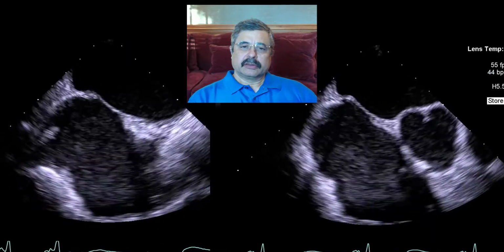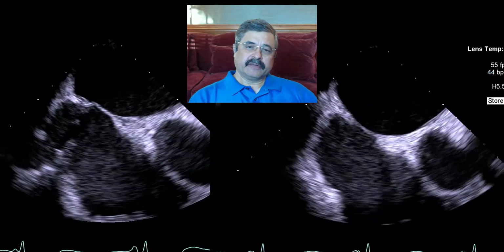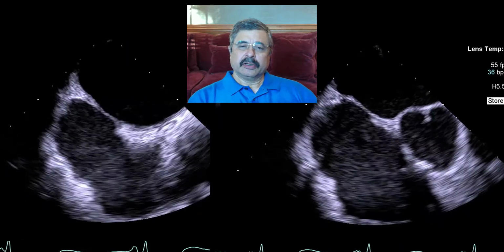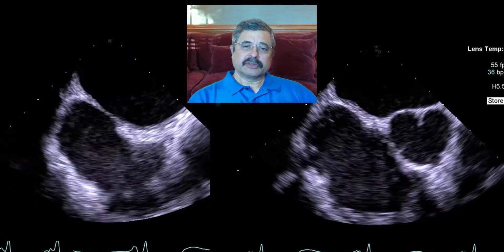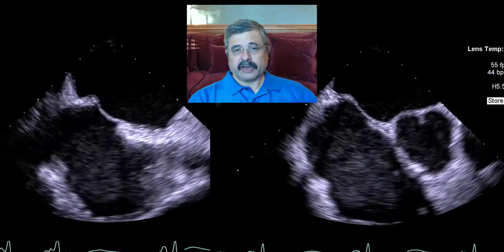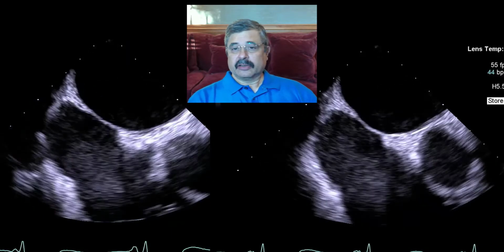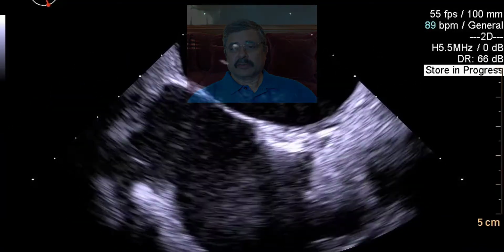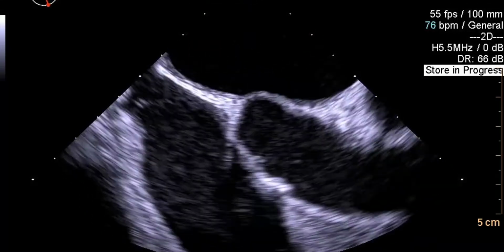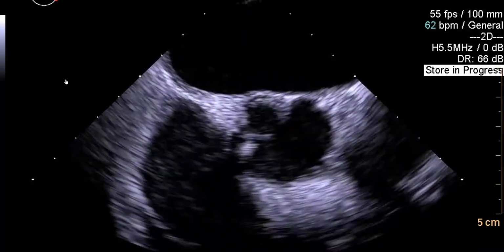Therefore, to optimize the trajectory of the device into the left atrium and its positioning above the mitral valve, we revised the transseptal puncture. And as you can see in this video, the indentation produced by the transseptal puncture needle is optimally located not only in the superior-inferior axis, but also in the anteroposterior axis. Significantly, the location of the indentation is more posterior than it was in the first attempt, and therefore the septum was crossed at this location to proceed with the rest of the procedure.